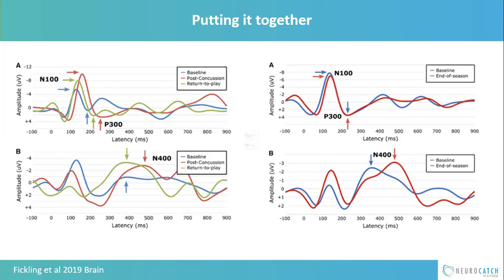You can see that the latency delay, the N400, which is broad and has this preceding PMN peak, looks to be in there, but the semantic processing is what was delayed. So the players changed in terms of their reliance on the sound expectation in the early season, and then their reliance on the meaning expectation. And that significantly shifted the overall peak in time.